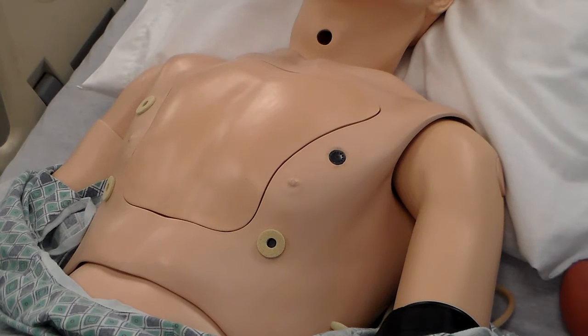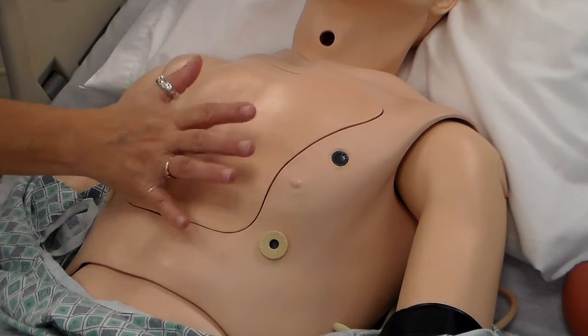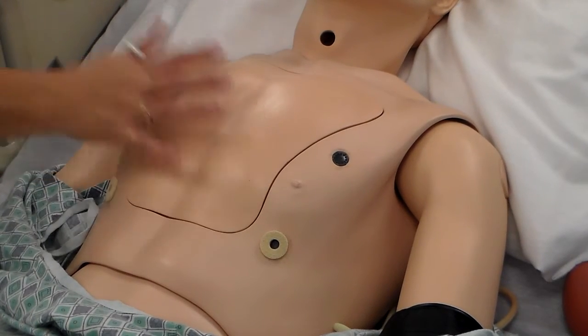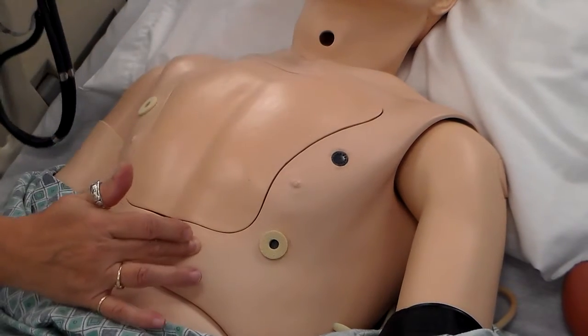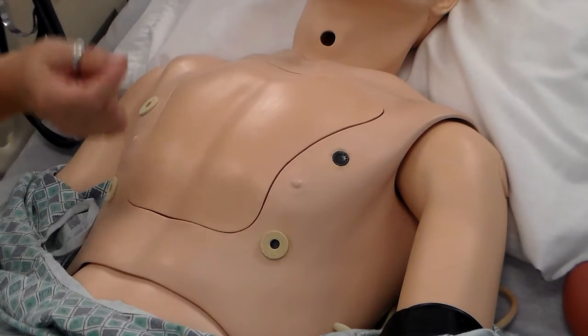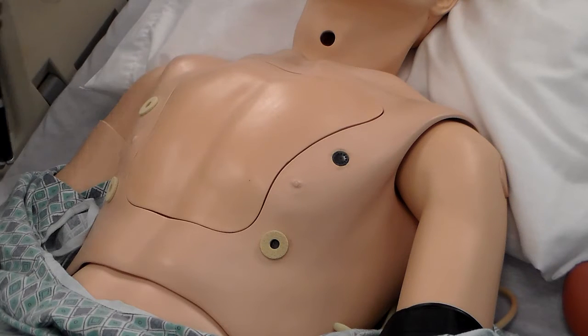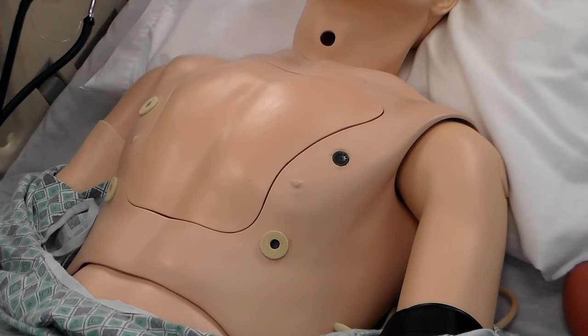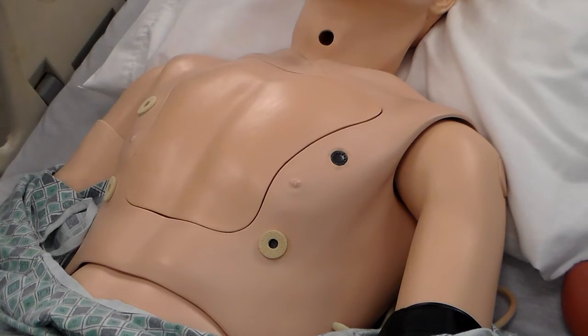First, we're going to start off with listening to the chest wall itself. I mean, to the front of the chest, okay? And we're going to listen 10 times, 5 on each side, on the front, okay? And then we're going to go to the back. When we go to the back, I'm going to pause the camera and position the camera correctly so you can see what I'm doing in the back, okay?